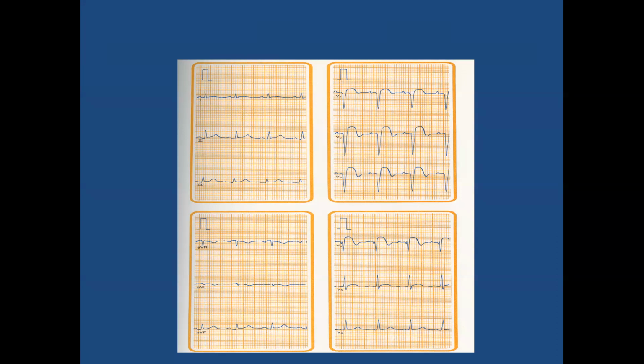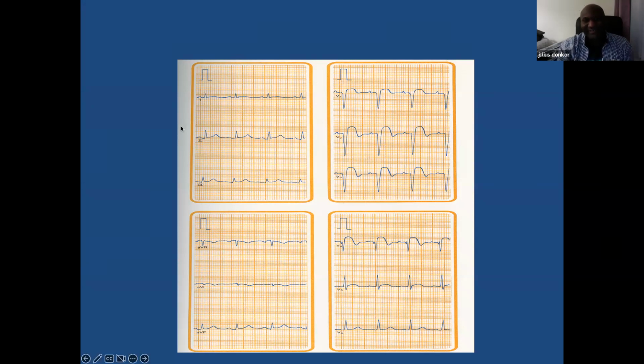Yeah, it's a normal sinus rhythm. Excellent. That's it, with anterior MI. That's fantastic. Yeah, so that's what I want you to say. So I'm preparing you for the IBHRE now, because you can see your ST elevation there.